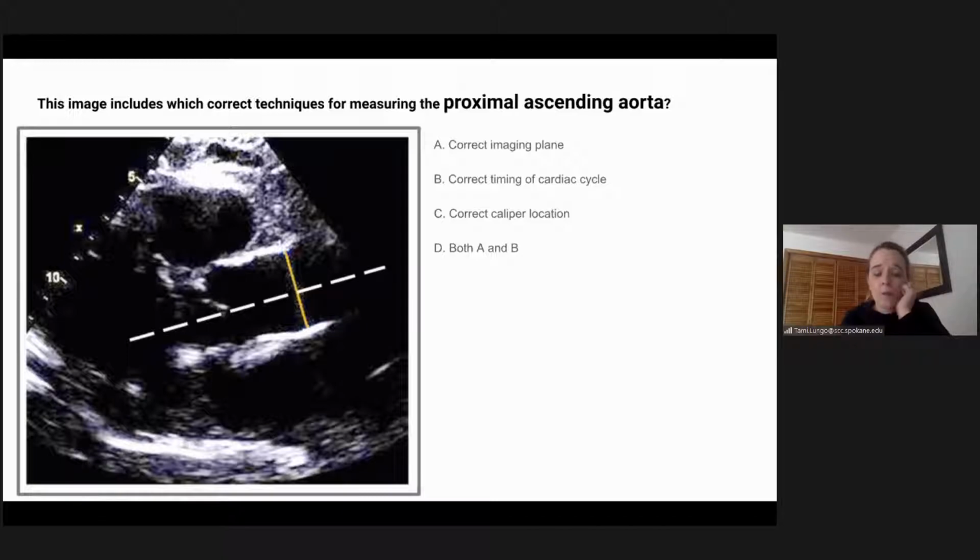I do both. In pediatrics, I do mid systolic, all inner to inner, and then end diastolic, leading edge to leading edge, and then you can't go wrong. They should probably be around the same measurements, but it's an ASE thing that the guidelines changed. In a baby, it's mid-systolic inner to inner; in an adult, it's different. It's just a thing they change, and they'll probably change it again in 5 years. I have no idea. The main thing is the doctors always measure it when they see it at its largest.